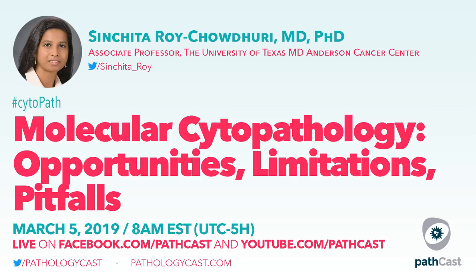Now, if all the diagnostic material is on one slide, that's a problem. We have done something in the past where we've scraped off most of the slide and retained a little piece that we will coverslip for our archival purposes. But if it's the only slide that's available for testing, we will either scan it in or take pictures, or make sure that we have something in the archives that establishes the diagnosis.